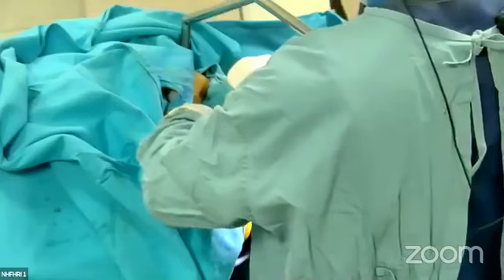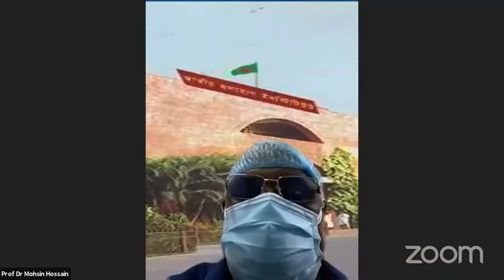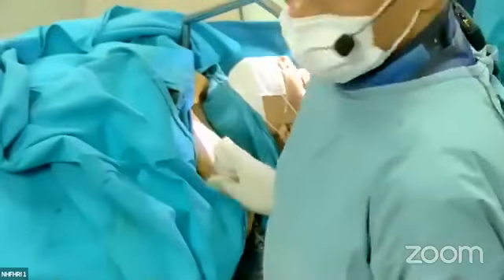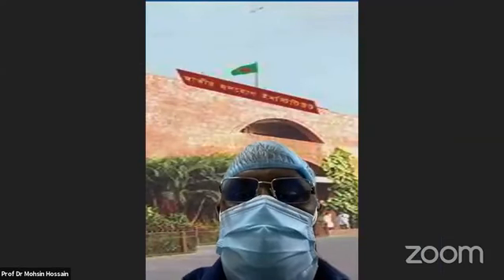আমার একটা কোশ্চেন আছে। স্টুডেন্টদেরকে পরীক্ষার সময় একটা কোশ্চেন করা হয় যে লিডটা এলবিতে, আরবিতে গেল, না করোনারি সাইনাসে গেল, এটা কীভাবে বুঝবে? ল্যাটারাল ভিউ করা হয়। মহসিন ভাই, এটা একটু ক্লিয়ার করে দেন স্টুডেন্টদেরকে, যে লিডটা কি ল্যাটারাল ভিউ দিয়ে দেখা হয়?